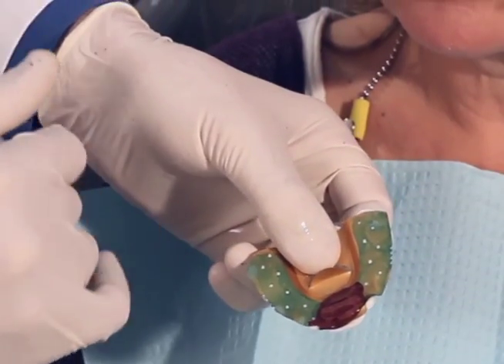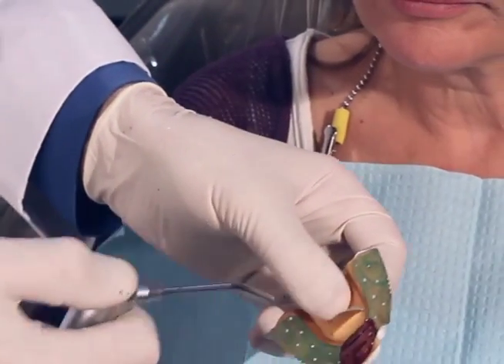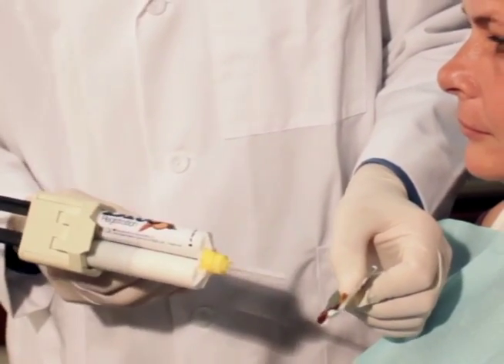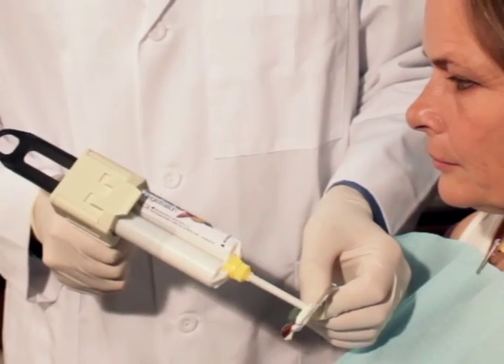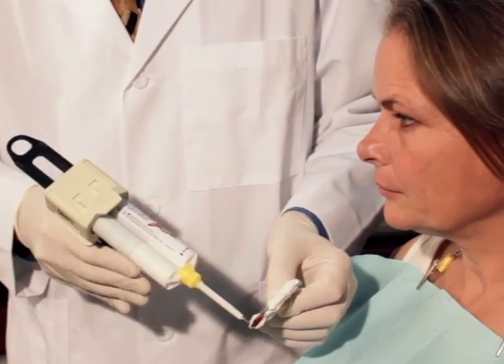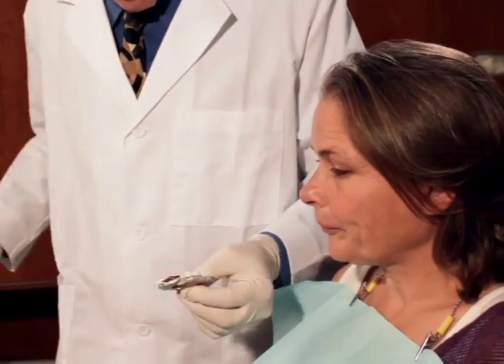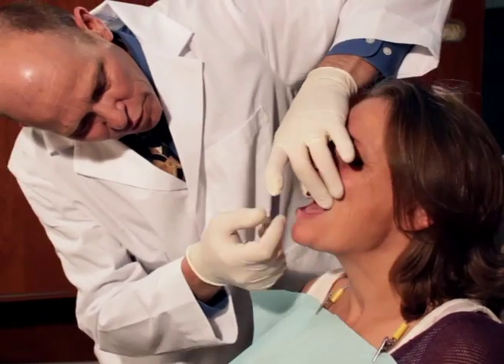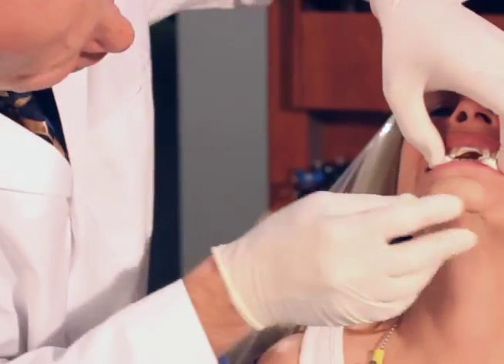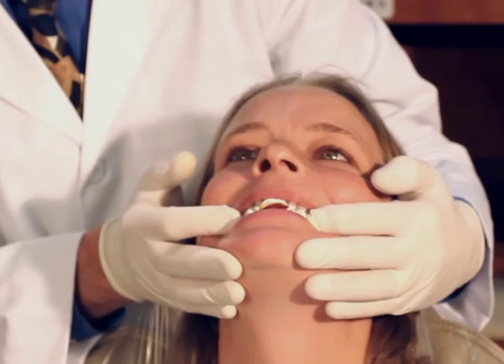So we're ready to add the bite registration material to the posterior area to finalize the protrusive record. We'll go ahead and dry off the lower surface of the bite tray and add our bite registration material to the lower posterior half. Knowing that this is a protrusive check bite, you can have much more space between the posterior teeth, so this time we're going to add quite a bit of bite registration material — really build it up to make sure we capture the teeth. We come back in and guide the patient forward into that protrusive check bite. Find your index.